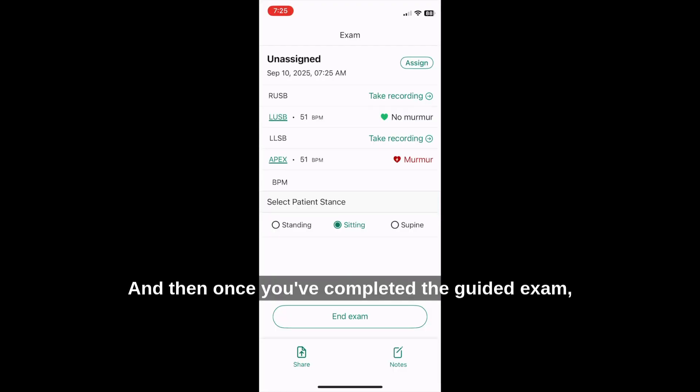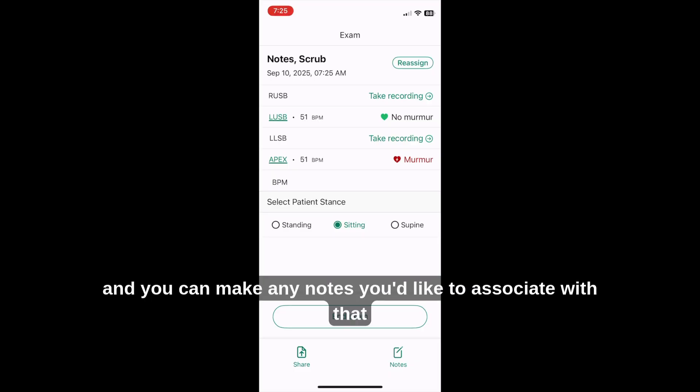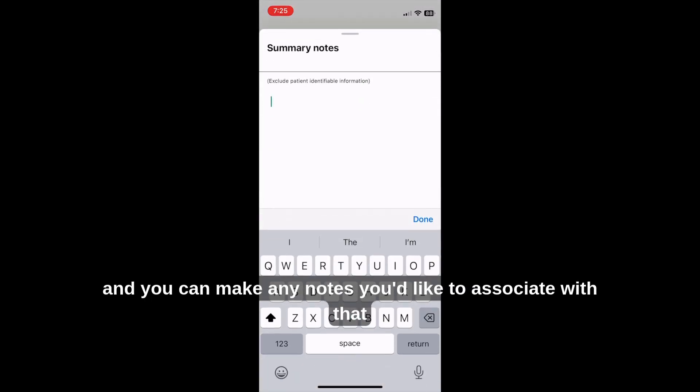Once you've completed the guided exam, it will analyze the data, and you can associate it to an existing patient or a new one, and you can make any notes you'd like to associate with that recording.